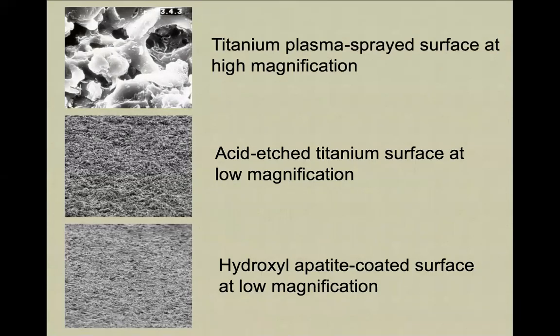The implant is not just a screw that might be screwed into wood or into a wall. It's not just a mechanical device that will hold all this loading. Permanent loading by the mastication process will lead to micro movements of any simple screw.